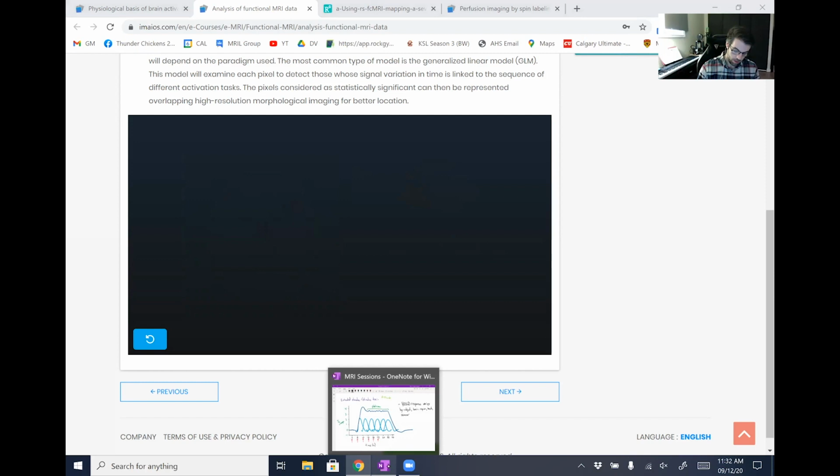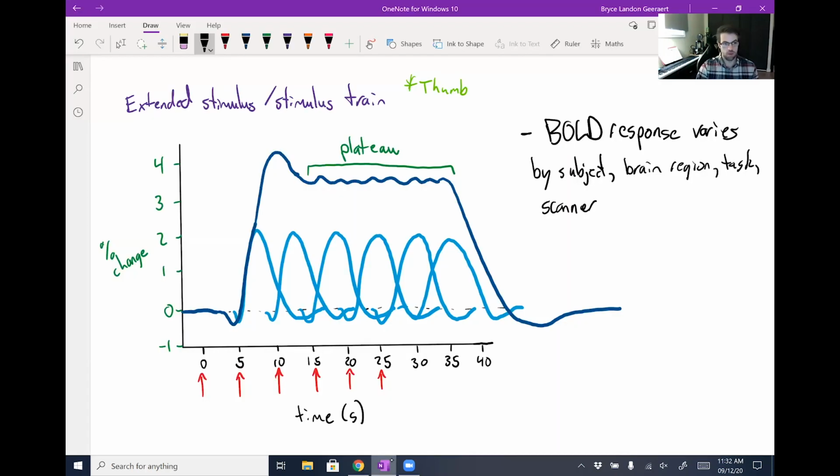Yeah, fMRI acquisitions tend to acquire thousands of volumes instead of just the one volume of the brain in the structural image, or 30, 35 volumes in the diffusion-weighted image. fMRI focuses on quick acquisitions, so you can see that change in blood flow on the smaller scale, and acquiring thousands of volumes quite quickly so that you can average them together and see that consistent increase in signal or no change in signal in the region due to the BOLD response or lack thereof, and cancel out some of the noise that is influencing your images.